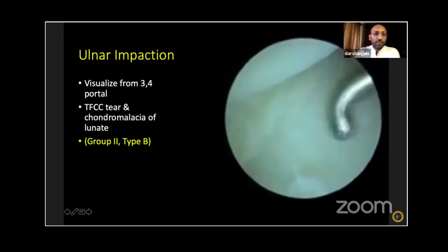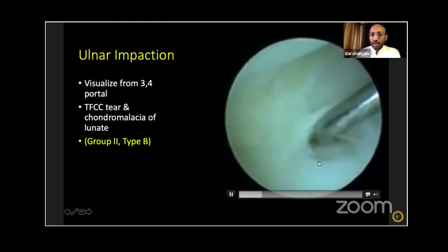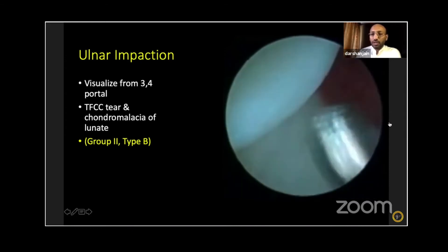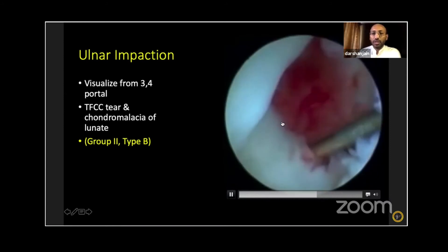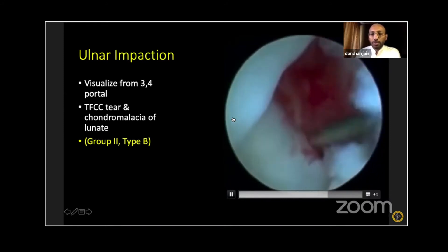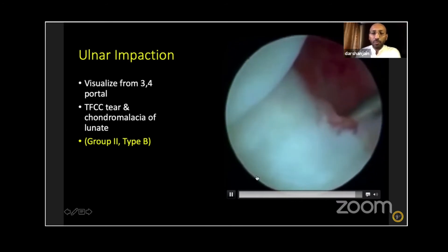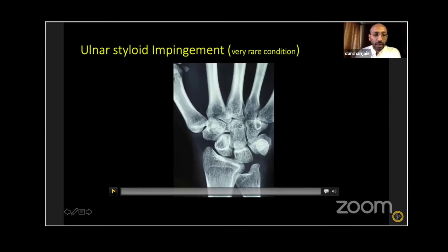There's another entity: ulnar impaction syndrome. Visualizing through the 3-4 portal, you can see a central TFCC tear. The ulna is seen — this happens on a pronated and dorsiflexed hand. There is a dorsal rim tear and softening of the chondral surface of the lunate. That's a dorsal capsular tear of the TFCC. You may not be able to repair the central tear, but the dorsal capsular tear is amenable to repair.